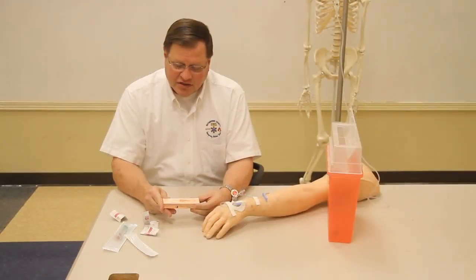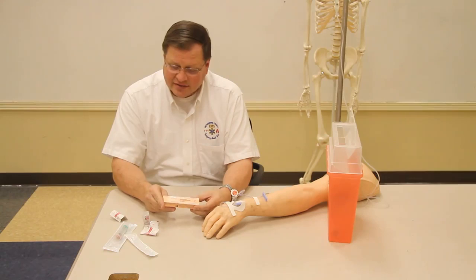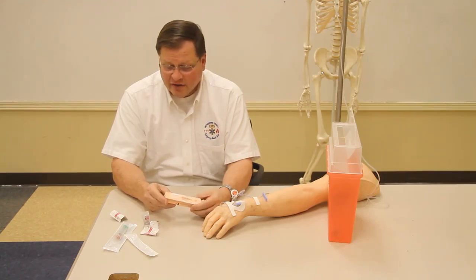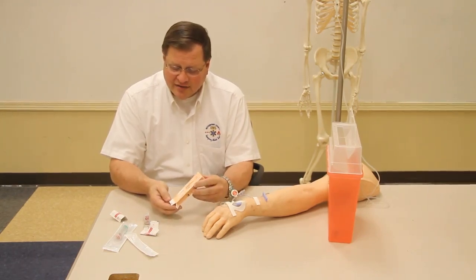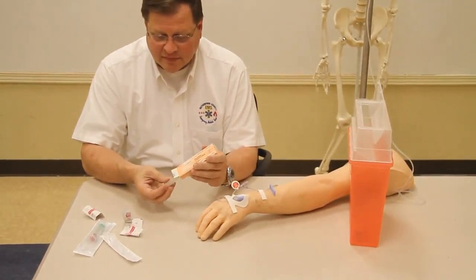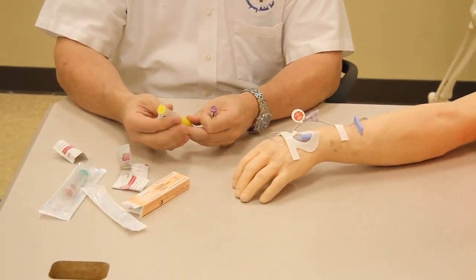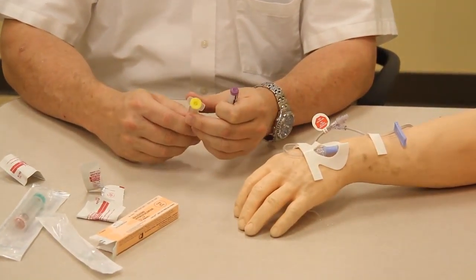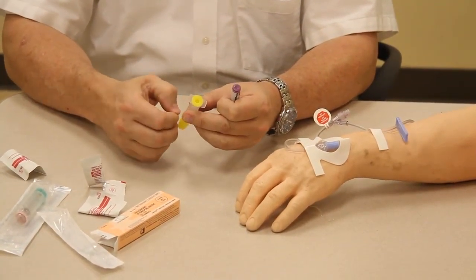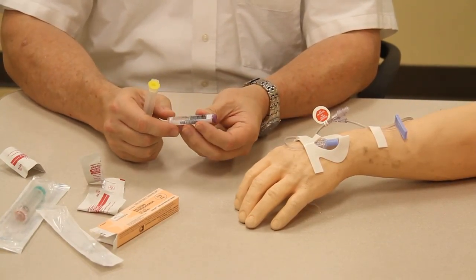The medication, naloxone, also comes in a Bristojet along with a multi-dose vial. But I have the Bristojet with me, and so I'm going to demonstrate the Bristojet. In the Bristojet, we'll open the box, and you'll have actually a 2-part syringe. One is the syringe. This particular syringe has a luer lock on it, and it is capped at both sides, so the inside is sterile. And the other is the medication itself.